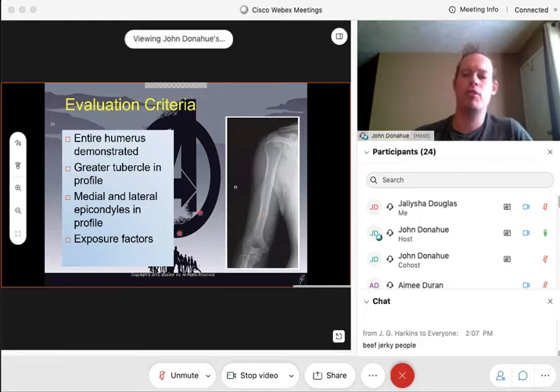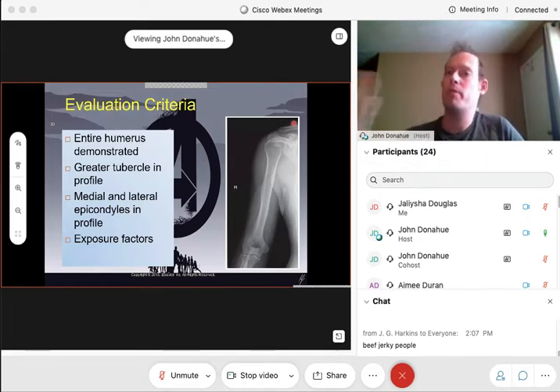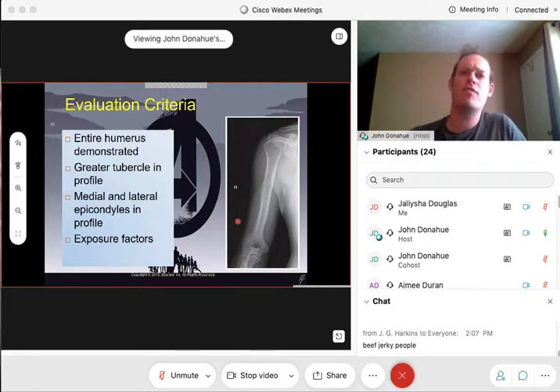For evaluation criteria — this is a beautiful humerus x-ray. We do want that entire humerus demonstrated from both joints, shoulder joint all the way down to the elbow joints. The greater tubercle does need to be in profile — we achieve that by having the hand supinated. If the hand is supinated like it would be for a forearm, that greater tubercle will naturally fall into profile position. We also want our medial and lateral epicondyles in profile at the distal portion of the humerus. Having that hand supinated with the arm straight out in front puts both the greater tubercle and both epicondyles into profile position.